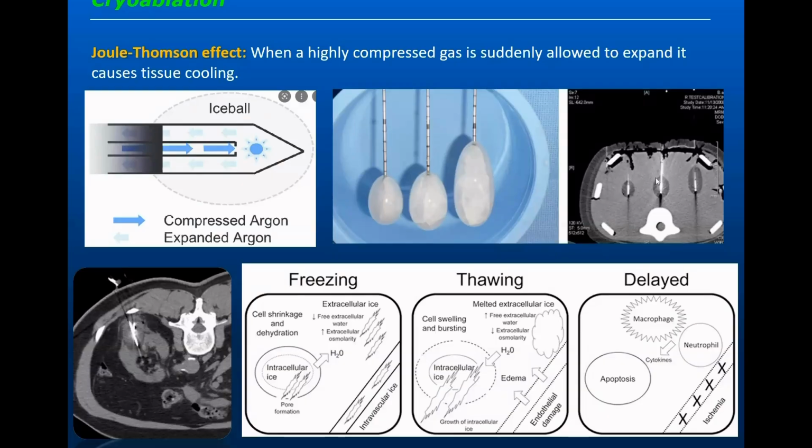This is the ice ball. And you see how beautifully you can see it. This 100% makes you sure that you are covering your target. Again, this is a case that I wanted to show you guys.